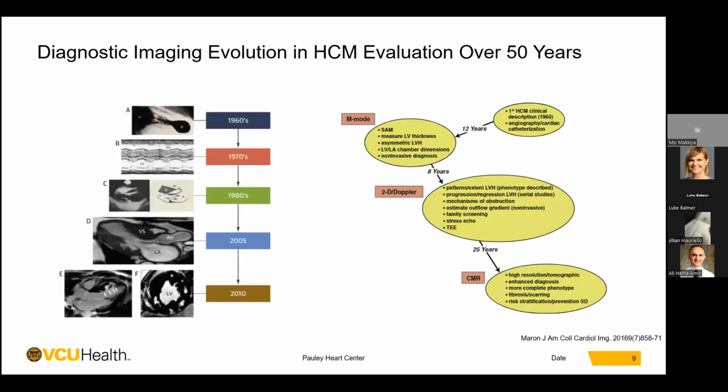Some history about imaging. I like this slide showing the central role of cardiac imaging in diagnosis of hypertrophic cardiomyopathy throughout the years, how we started and how we are now.